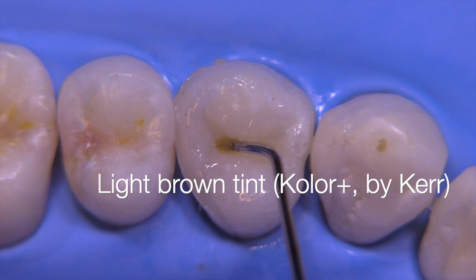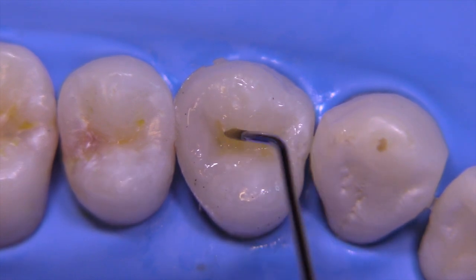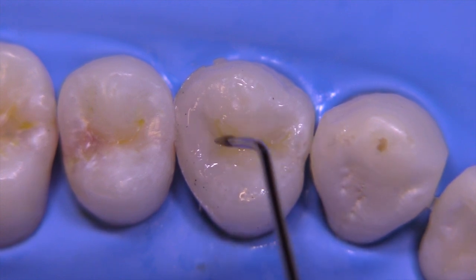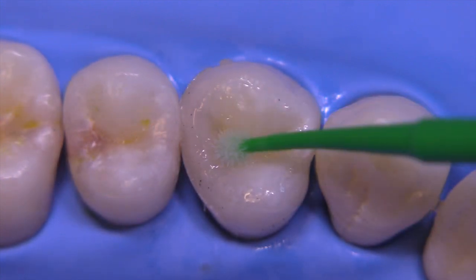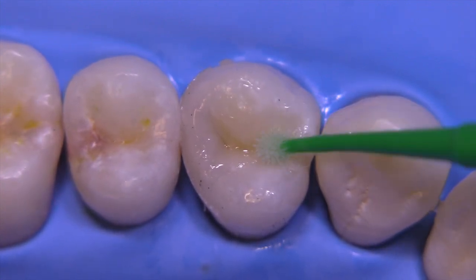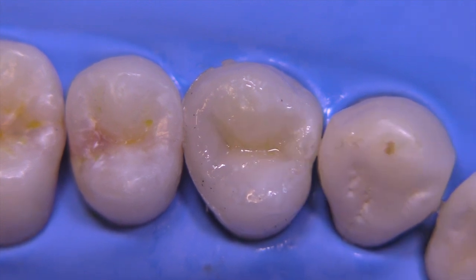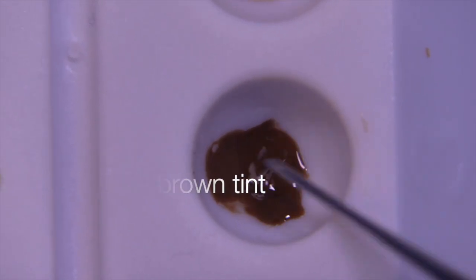This is a perfect time to use a little bit of tints. I'm not a big fan of tints usually, because most patients are perfectly happy with a composite that has a more monochromatic, untinted look. But today I'll show you how I might use tints — just to give a little bit of a rich, dentin look. We'll light cure this tint. These are all hybrid materials; these tints are hybrid and very strong.